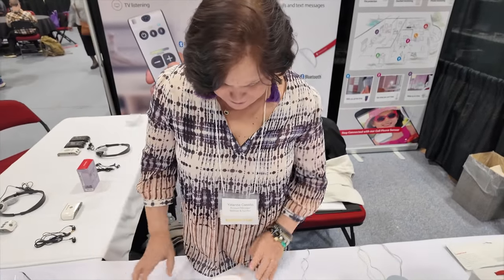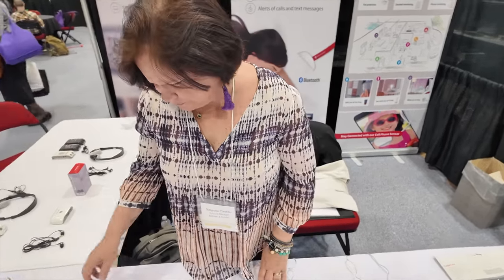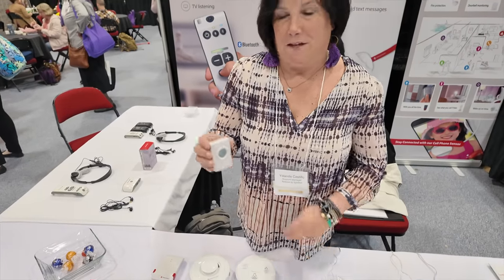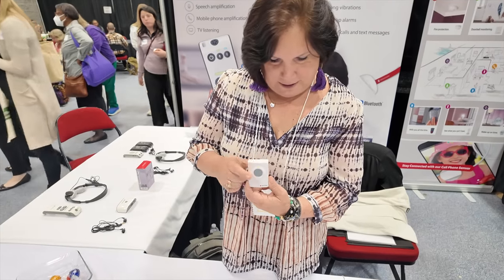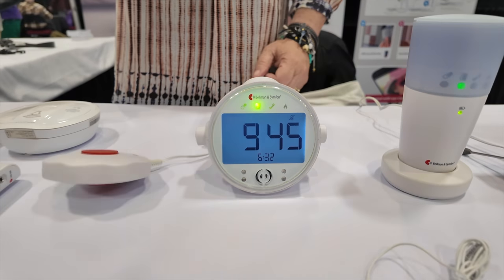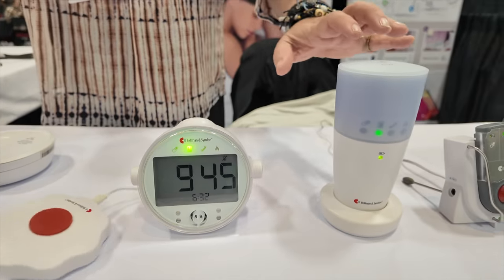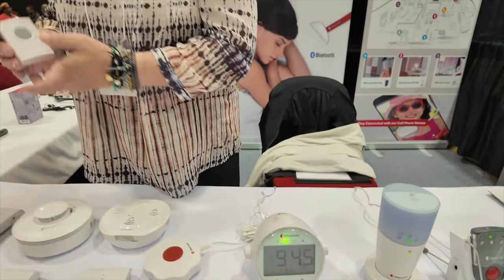Basically you have different systems here that will alert and go into a receiver. So for example, you have someone that needs to ring the doorbell. They would use this device, and it would ring the doorbell. The doorbell will notify any of the receivers that the customer has purchased, so you got a visual, you got a vibrating, and you got the audible. That is nice. Correct.